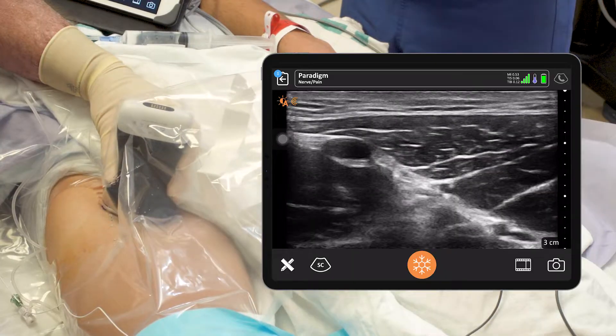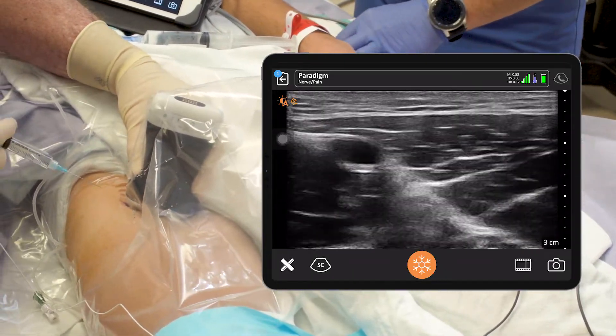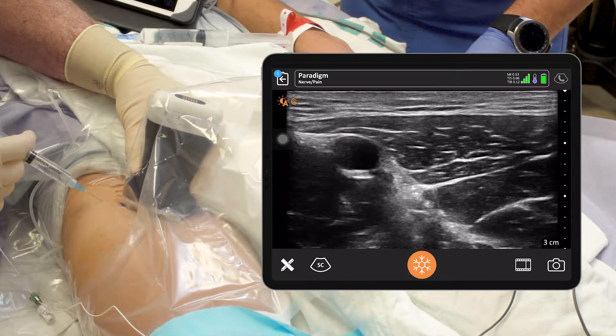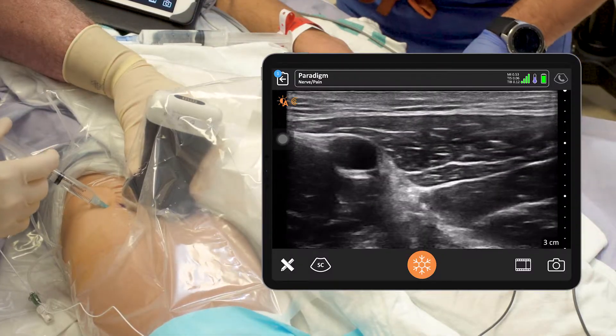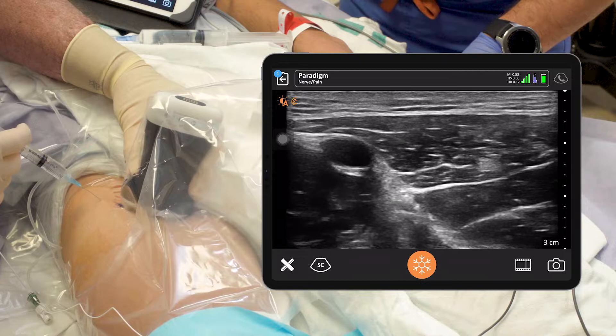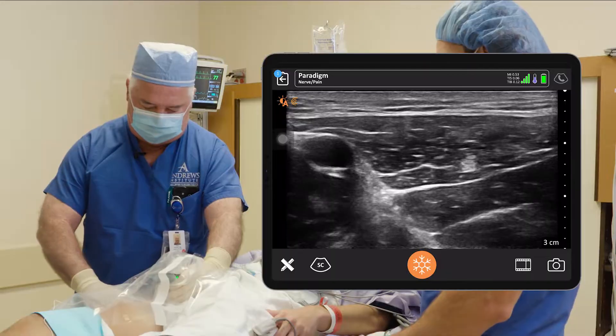Nice image here of the sartorius. We're going to put a little numbing shot in here — big sting on three, don't jump on me now. One, two, three. A little burn right here now. Good job, you're doing great.